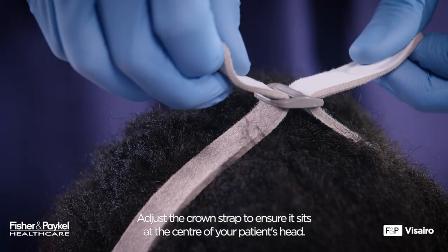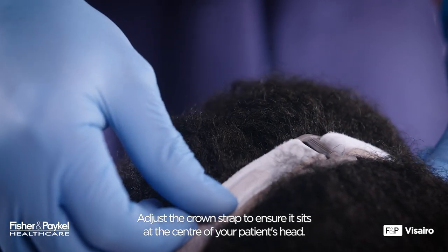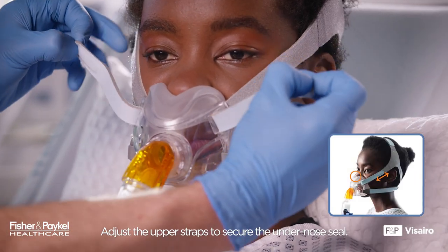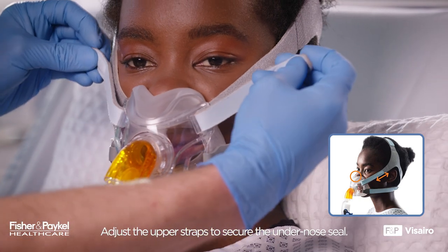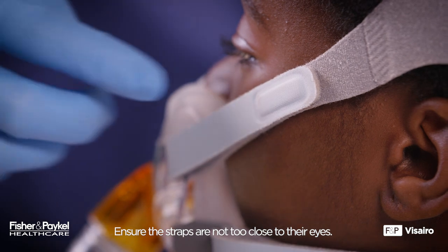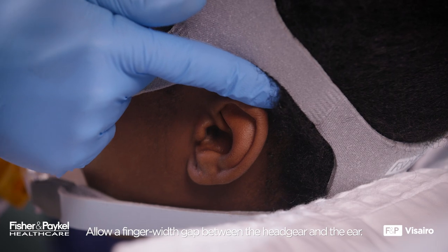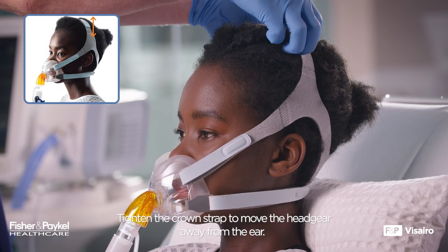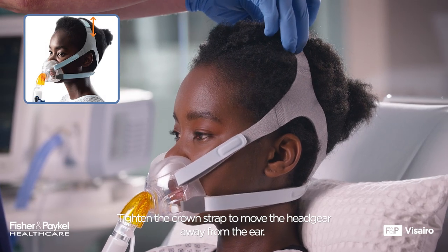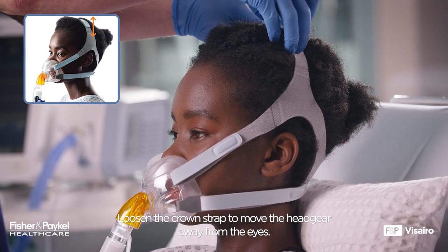Adjust the crown strap to ensure it sits at the center of your patient's head. Adjust the upper straps to secure the under nose seal, ensuring the straps are not too close to their eyes. Allow a finger width gap between the headgear and the ear. Tighten the crown strap to move the headgear away from the ear, or loosen the crown strap to move the headgear away from the eyes.